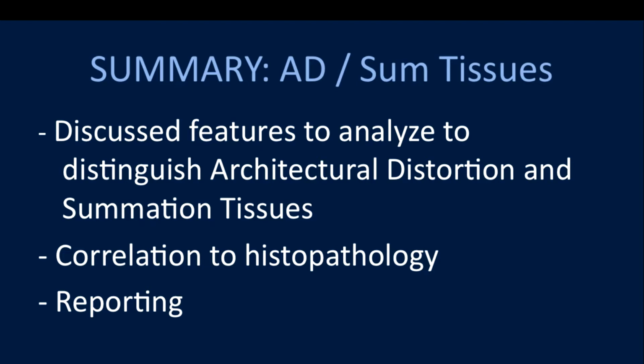My one caution would be if you get stromal fibrosis when you're doing a tomo biopsy or a 2D biopsy of distortion, that's not necessarily concordant. We've had 1 or 2 little cancers where we got stromal fibrosis, and then in follow-up we picked it up. So I don't know if that's really a concordant explanation.